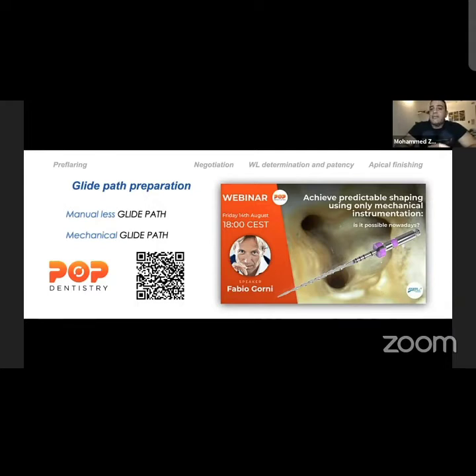If I'm a clinician or a fresh graduate or new to the practice, please be patient. Don't challenge yourself to go directly by rotary instrumentation. Once you have good training, once you develop your skills, I think in more than 90 to 95% of cases you can go directly by rotary.